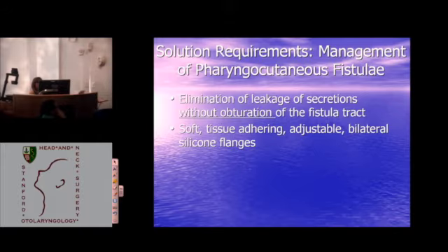And doing that with soft flanges and an elastomeric cord that is 8 French in between. I started hand making these probably 9 or 10 years ago for fistulas in our practice. And then through voice restoration, clinicians and various docs around the country said, well, I understand you've got this, and can you make me one?